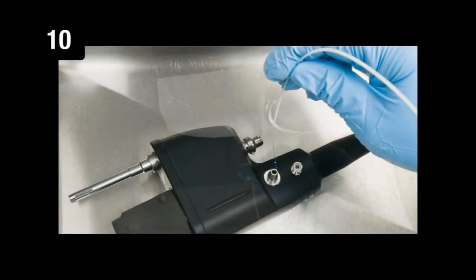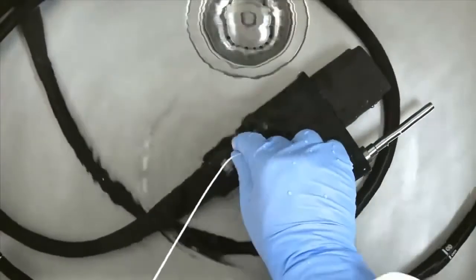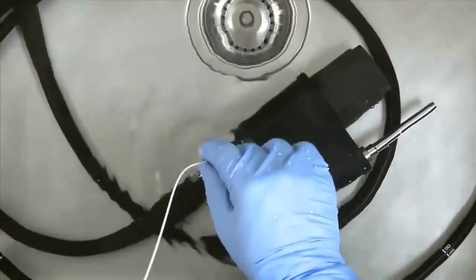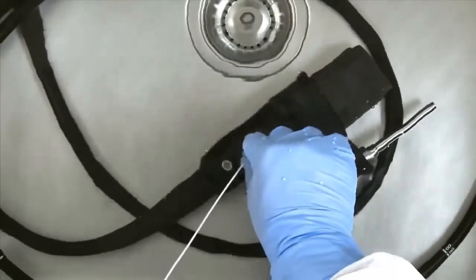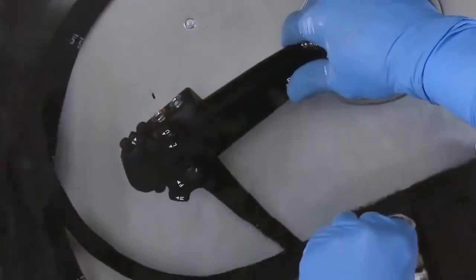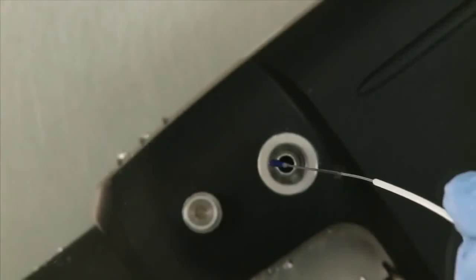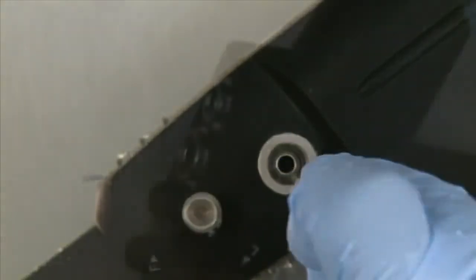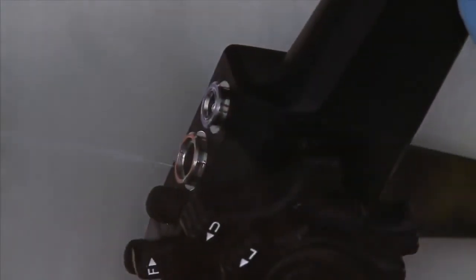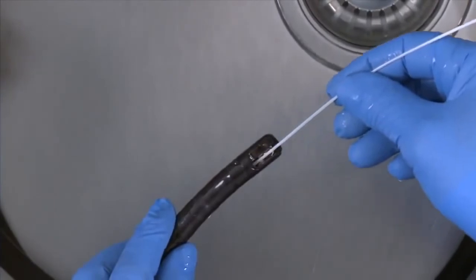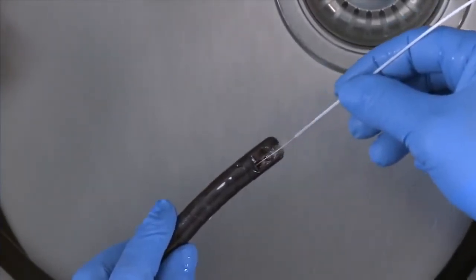Step 10: Brush the endoscope's channels. Using the long disposable channel cleaning brush, brush the suction port from the PVE connector at least two times or until the bristles emerge from the suction channel cylinder visibly clean. Ensure that the blue tip is inserted first. Pass the same brush through the hole in the bottom of the suction cylinder on the control body at least two more times or until the bristles emerge from the distal end of the insertion tube visibly clean.